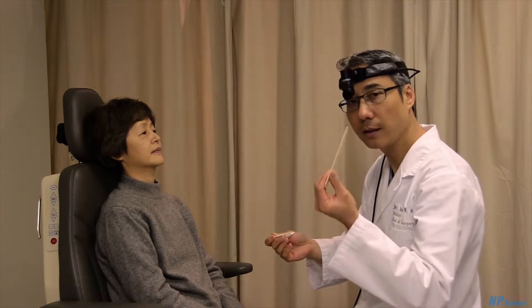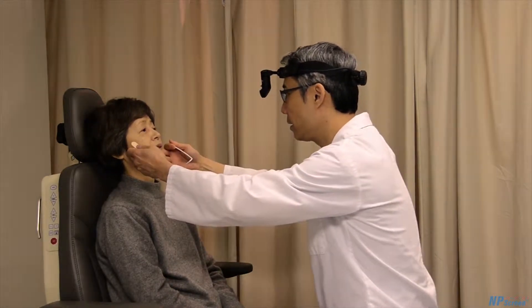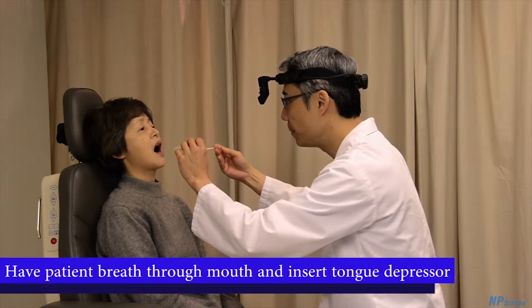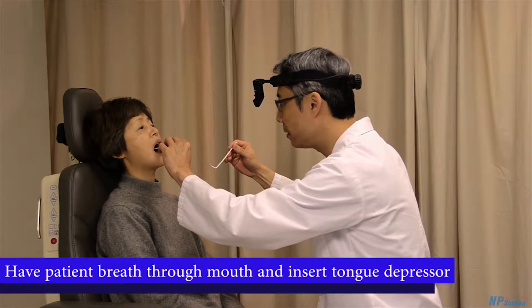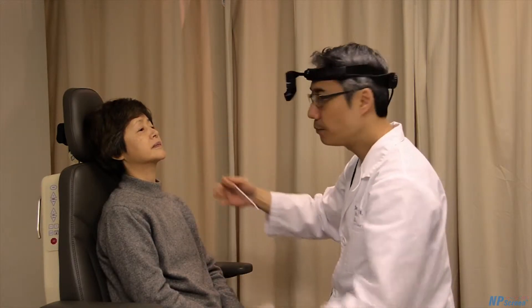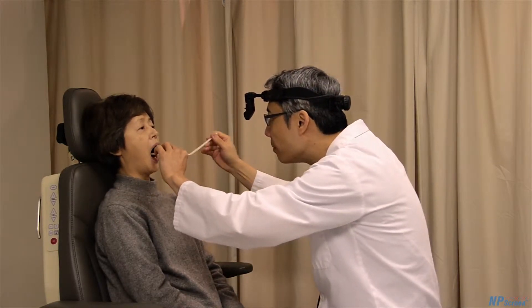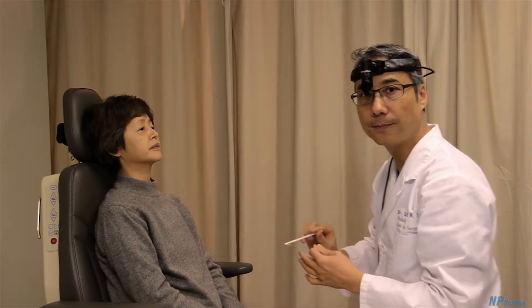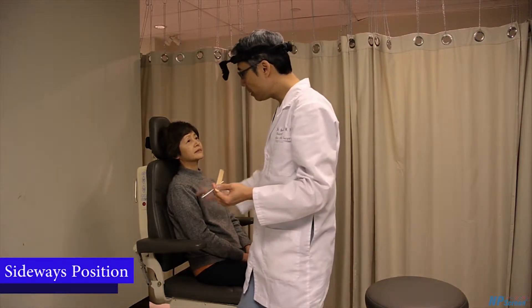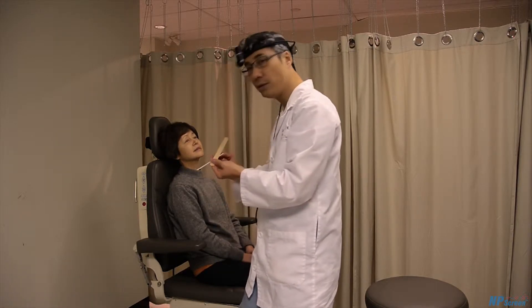I'd also like to have a line of vision parallel to the oral cavity so that I can do the brushing. With one hand I have a tongue depressor, and with the other hand I have the brush. I have the patient sitting comfortably in front of me, open the mouth, breathe through the mouth, and then gently insert the tongue depressor into the oral cavity. With light illumination, I insert the brush into the oral cavity. Another useful position is standing to the right of my patient, with the patient looking slightly toward me, and then performing the same procedure.